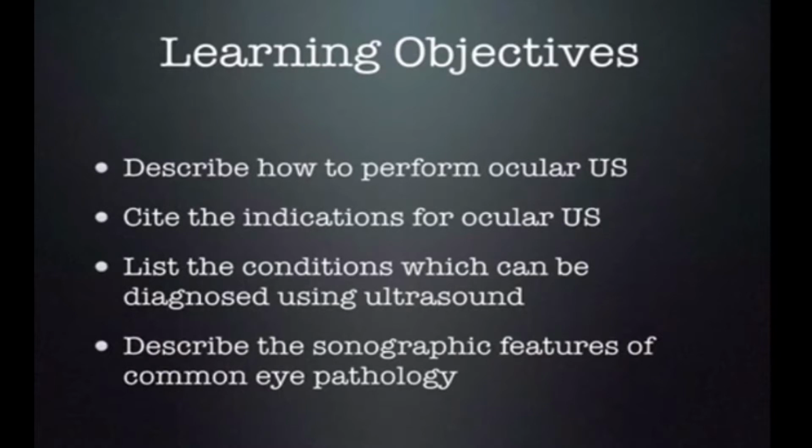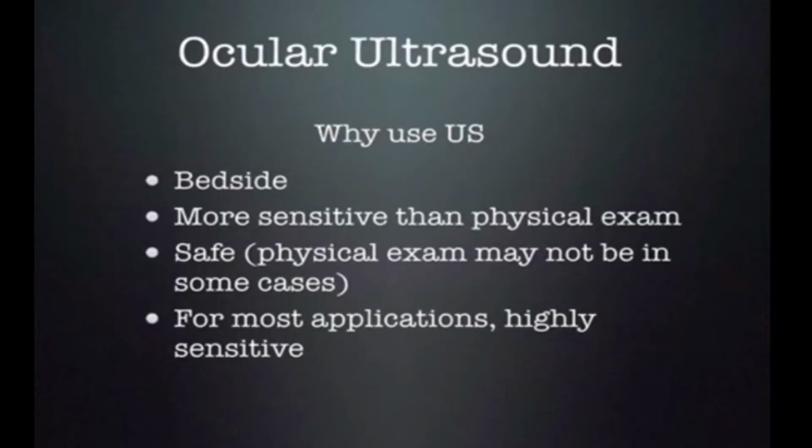Our learning objectives are to describe how to perform ocular ultrasound, to cite the indications for ocular ultrasound, to list the conditions which can be diagnosed using ultrasound, and to describe the sonographic features of a common eye pathology.